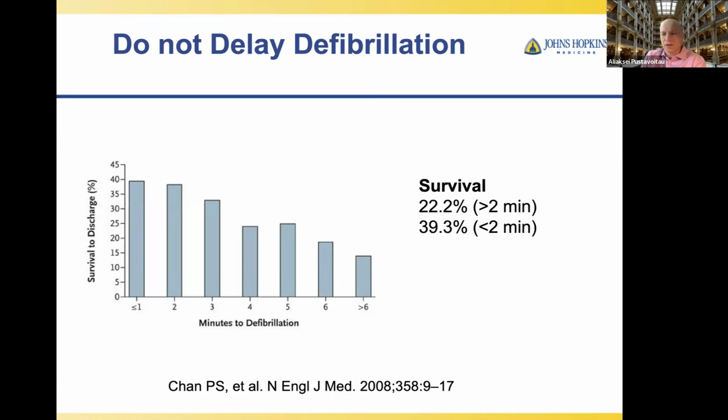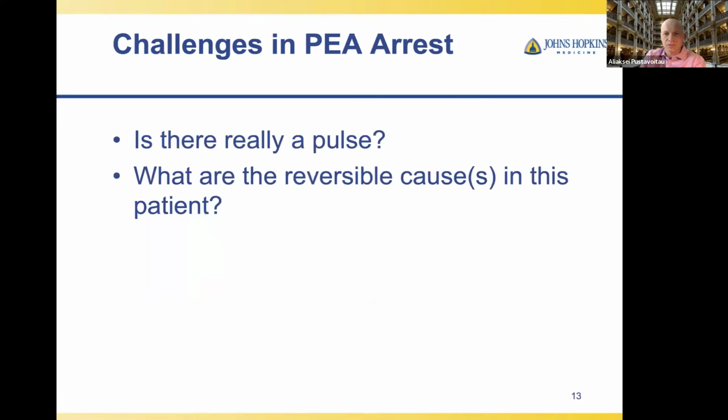And this is actually one of the things when we don't use ultrasound, because that will delay defibrillation. So that's one of the things we teach residents, fellows, faculty. When you see that, just defibrillate, don't delay. Everything else will cause a problem.